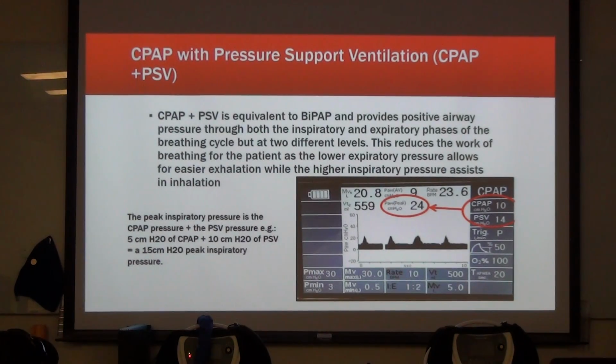You take that breath, it's going to breathe for you, and it's going to give you what you need in that pressure. So what's interesting is sometimes if you're actually doing an interfacility, they'll go, well, I want this to be 24/10. That's the order they'll give you. And you go 24/10. 24 is the total with the peak and the PIP, and basically with the constant pressure and then the inspiratory pressure combined is the 24. But you have to subtract that total from whatever your PEEP is.